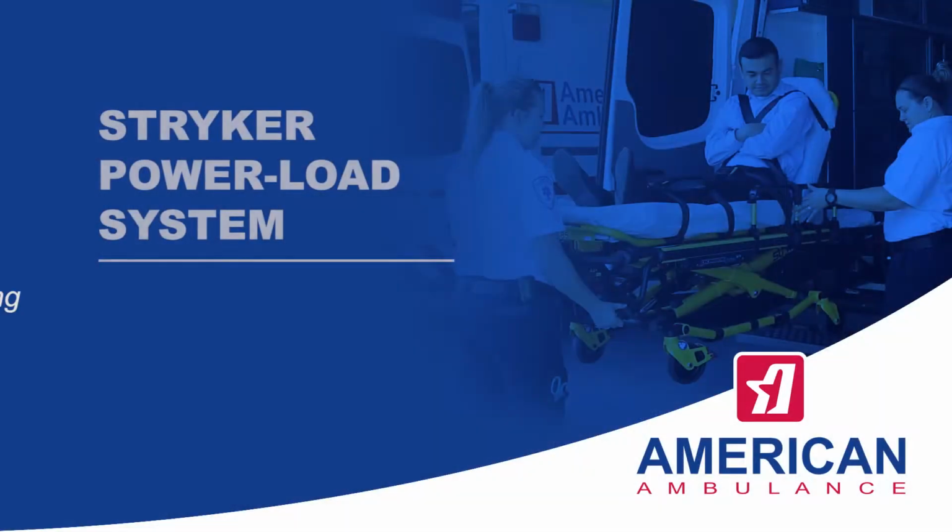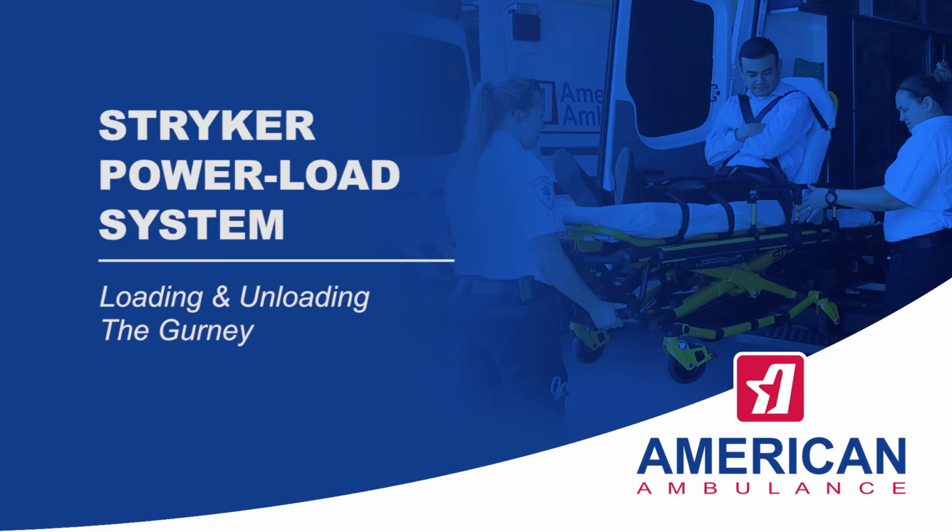Hi there, this is Edgar Escobedo, and I'm just going to talk to you about loading and unloading the gurney with the power load system. A couple things you need to know. This is a new power load gurney. It's a little bit different than our current gurney, and they should not interchange. The power load gurney can only work on the power load system.